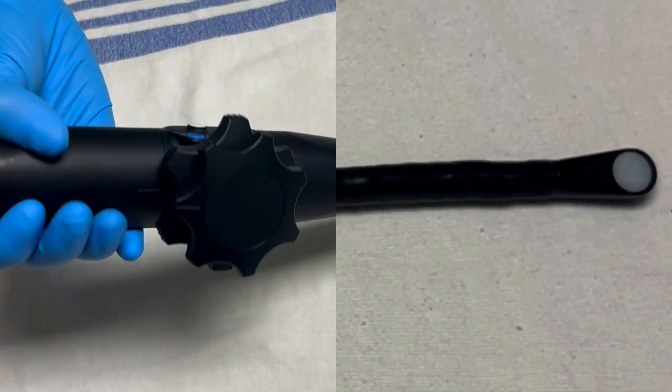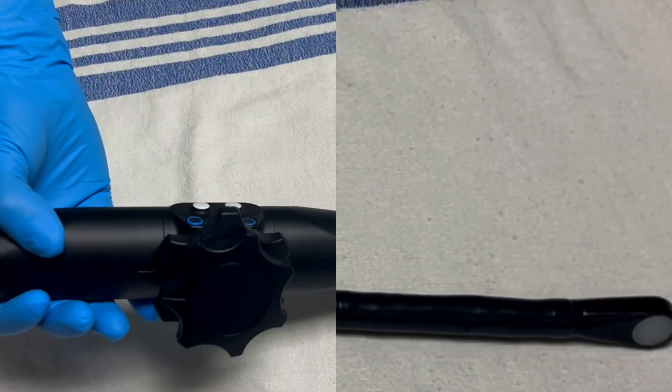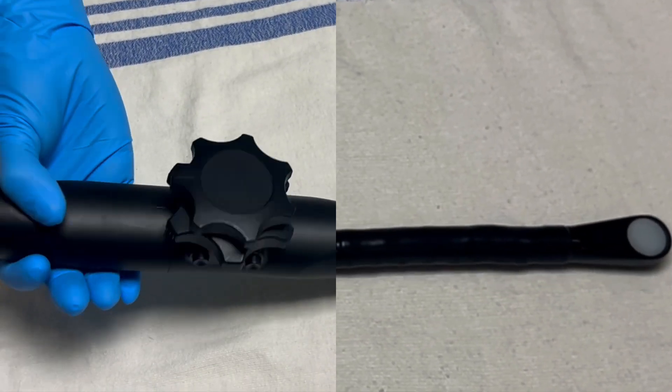The next movement is rotational. Because the control handle is contiguous with the head of the probe, moving your wrist clockwise and anti-clockwise will perform the exact same movement at the head of the probe.